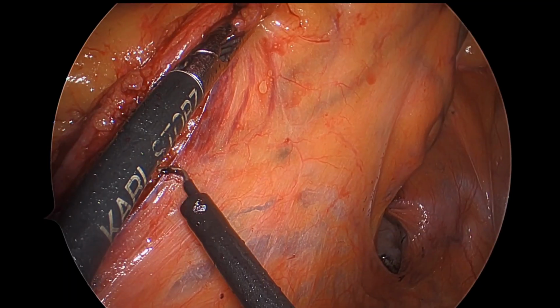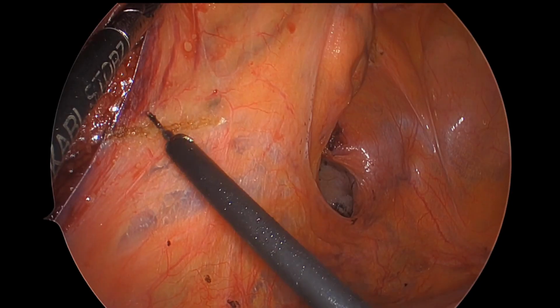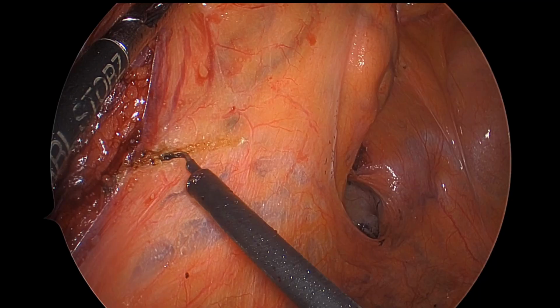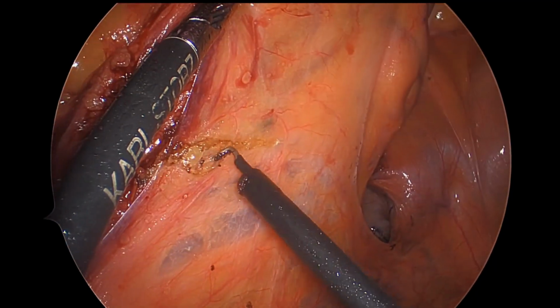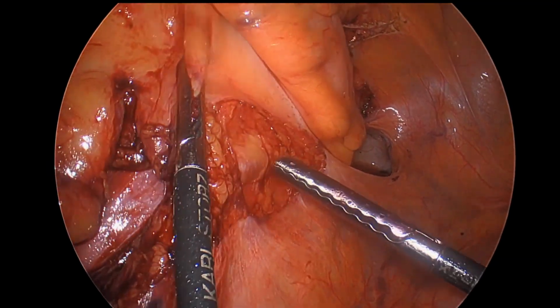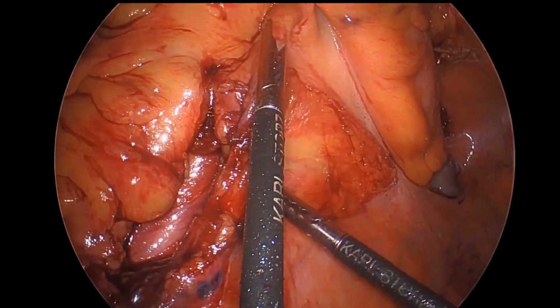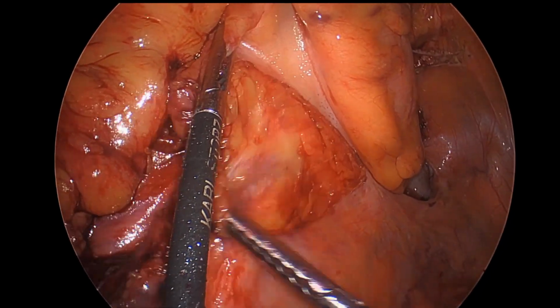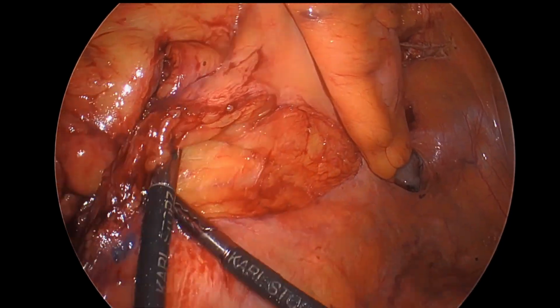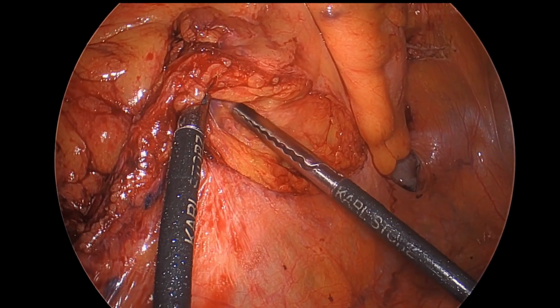Now we're actually establishing the true plane under the IMA pedicle. And in a moment, you're going to see that we establish the correct plane towards the mesorectum. I'm bluntly sweeping away the retroperitoneum here. Again, just being careful as we're still not quite sure of the anatomy here. But this is a good video that indicates all the principles that I tried to illustrate.